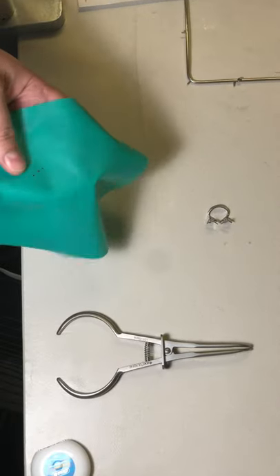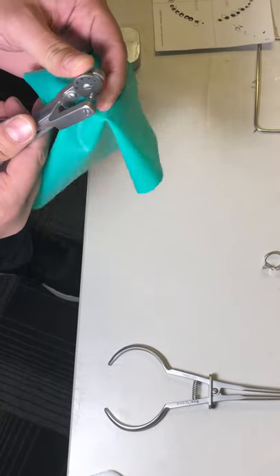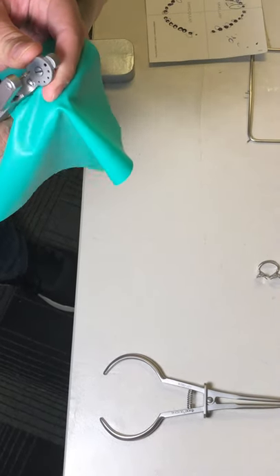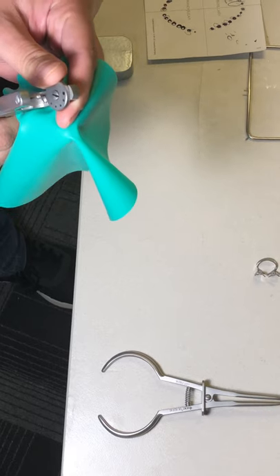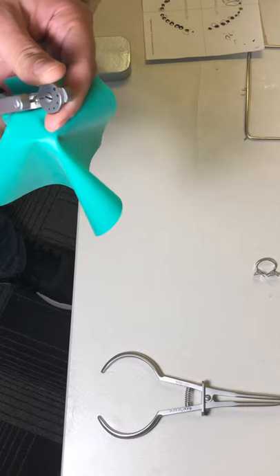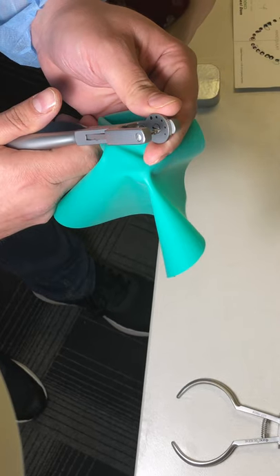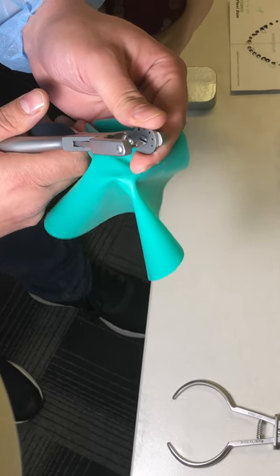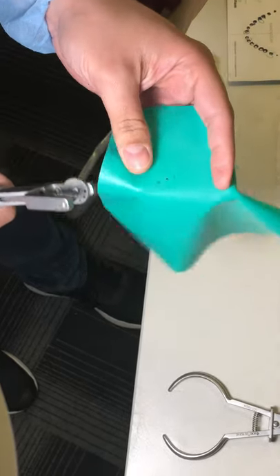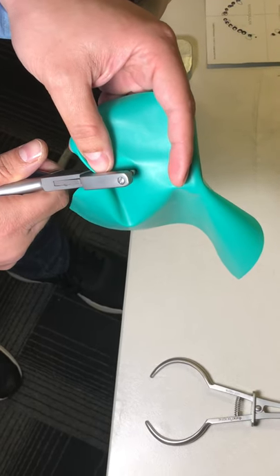After marking, we make the punch holes. We have five or six holes: the first is for the molars that need to be clamped, the second for molars that won't receive a clamp, the third for the pre-molars, the fourth for the upper centrals, and the fifth for the lower centrals. I'm going to make the first punch now — the largest hole — because the first molar is going to be clamped.